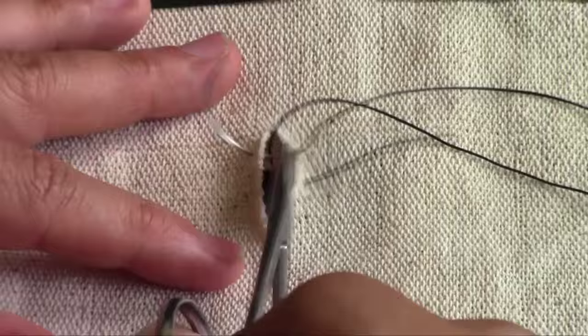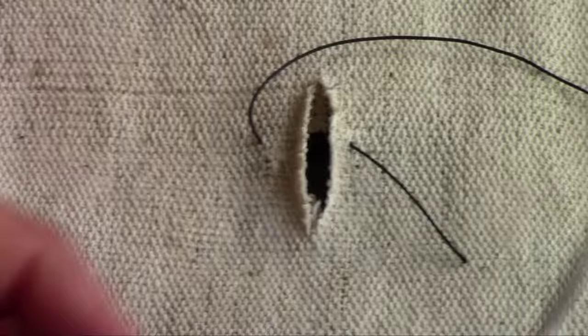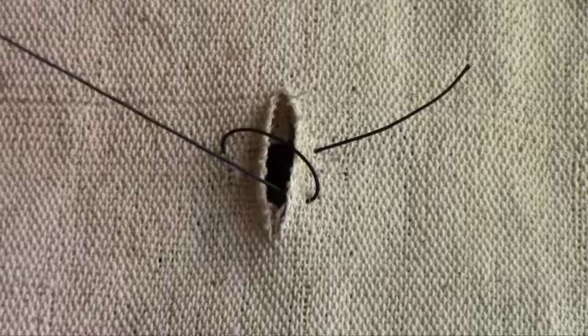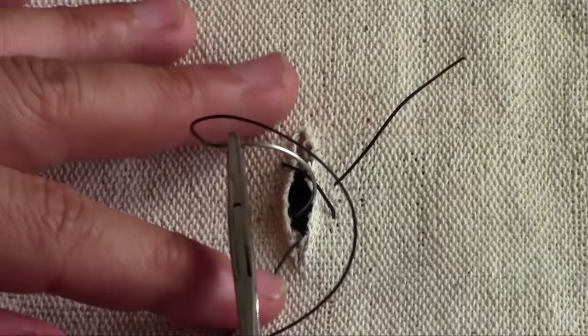It starts just like a simple interrupted suture. Then, instead of tying a knot, you come across. Create a diagonal line, which is the start of the 8.